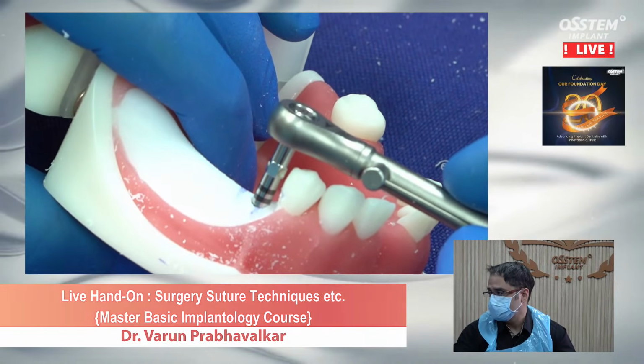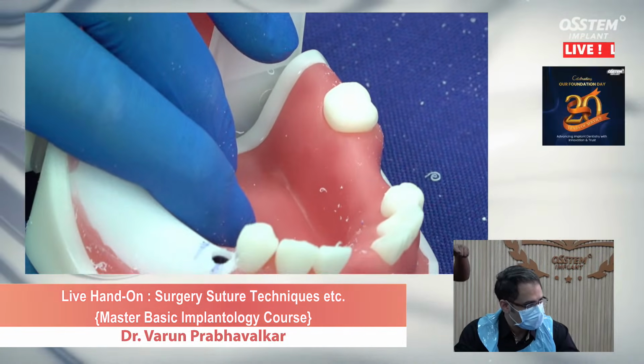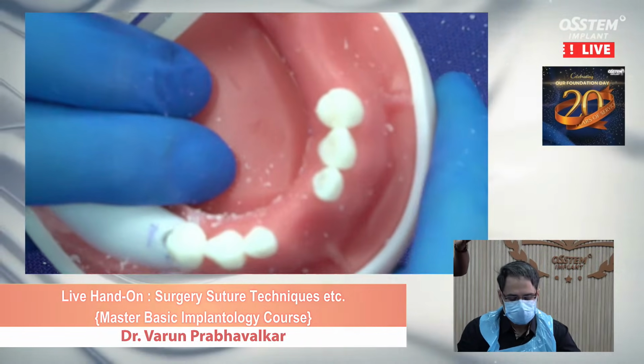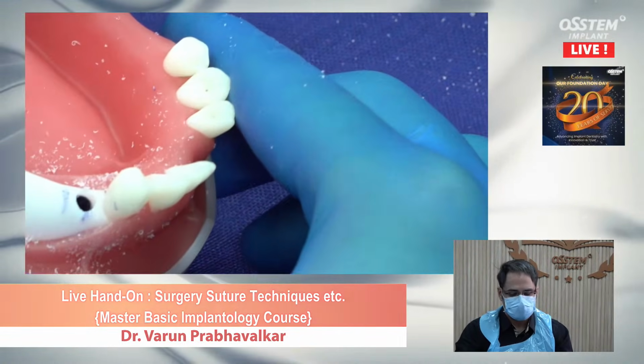Do you have a cover screw? Yes. This is our placement of the implant.